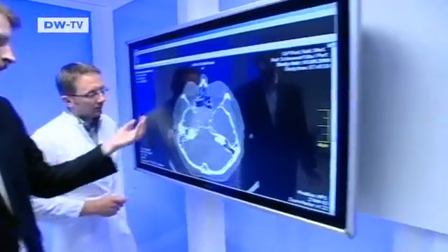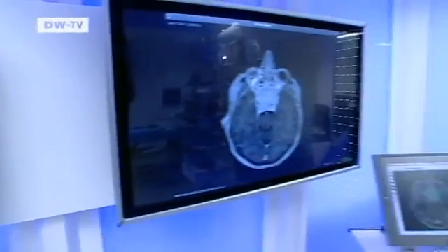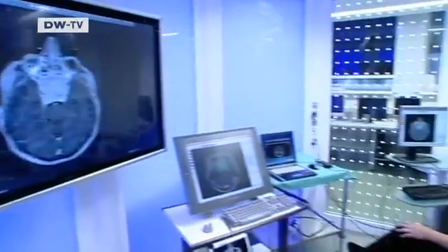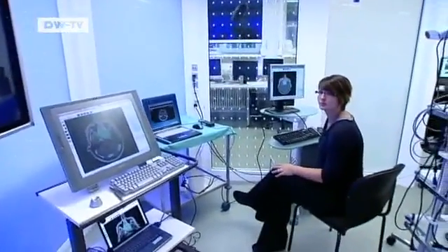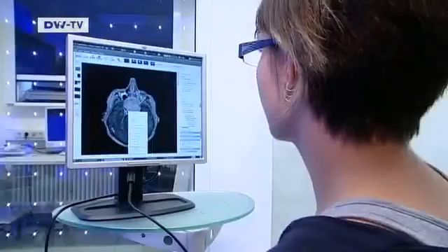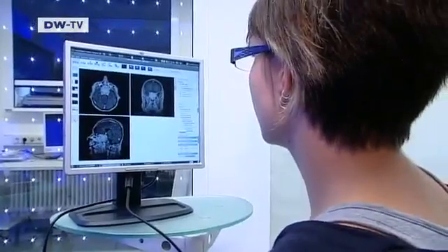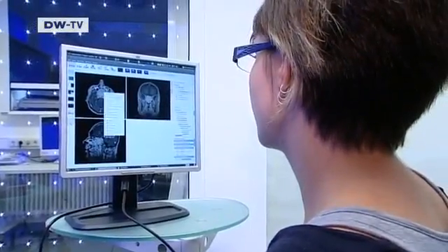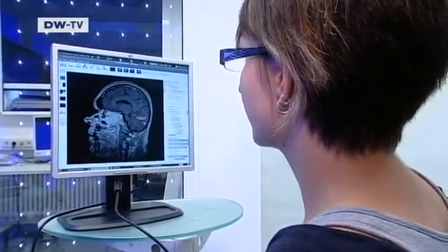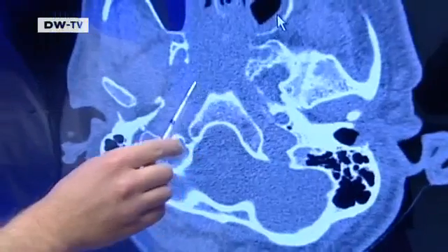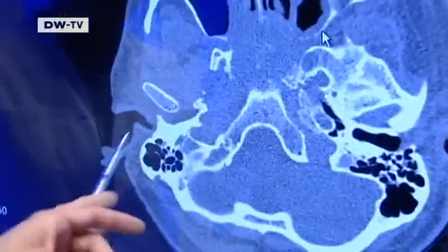This promises to be a tricky operation. A large tumour has to be removed from a patient's head. Images from the initial scans show it's located very close to the eyes and optic nerve.